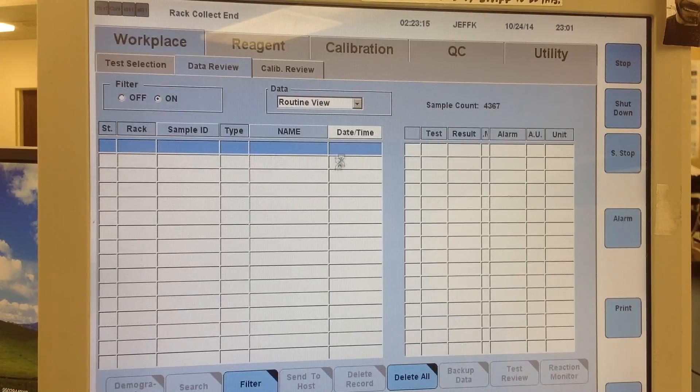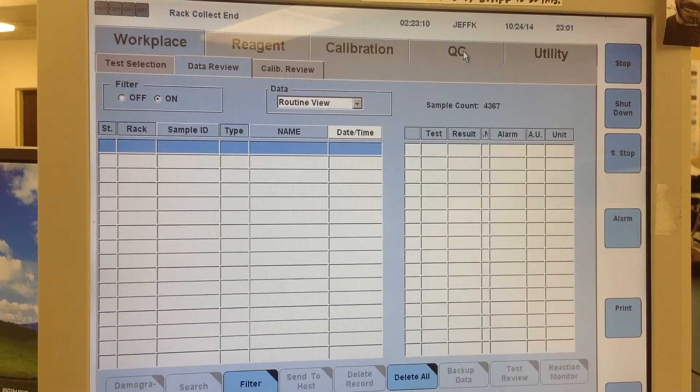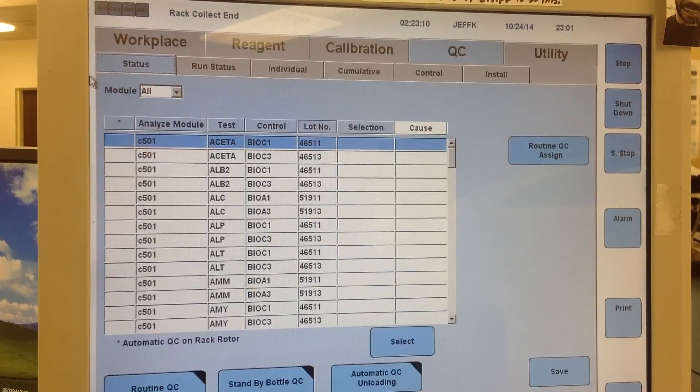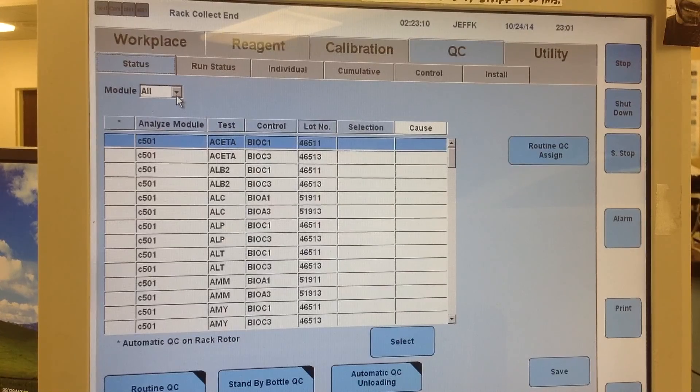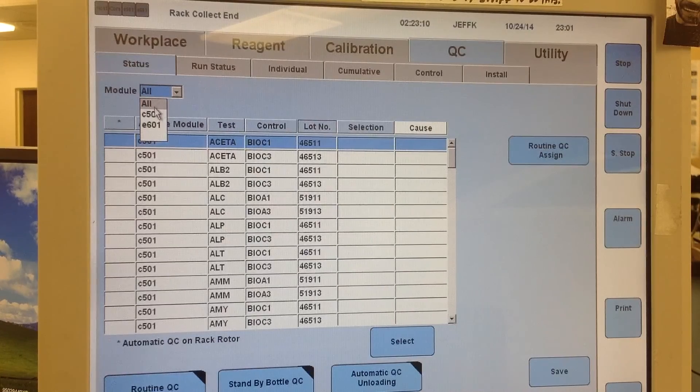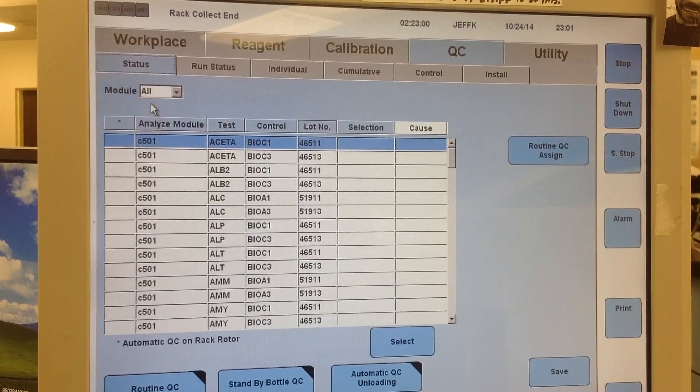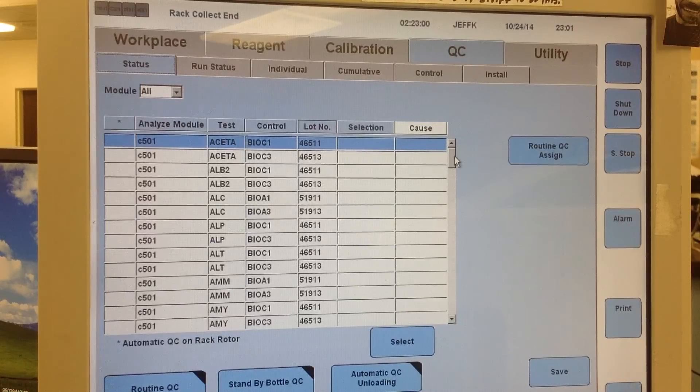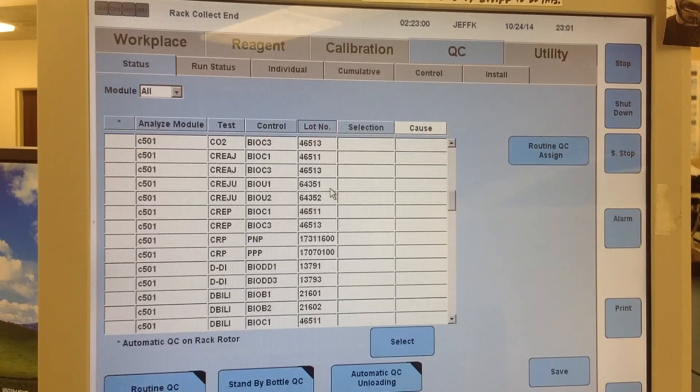So if you're in the workspace, you would go to the QC tab. From here, in status, you can switch between the different modules, or you can keep it on all so that you can see all of the tests that you have and the QC you can order for them.